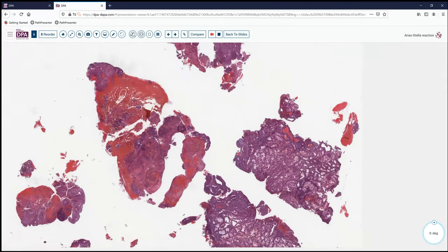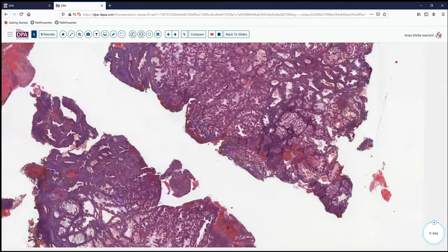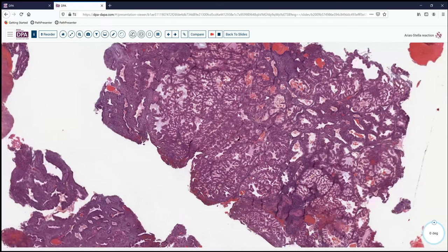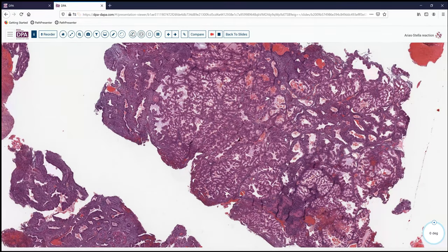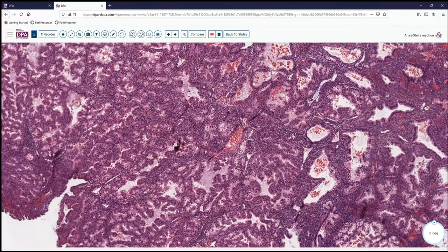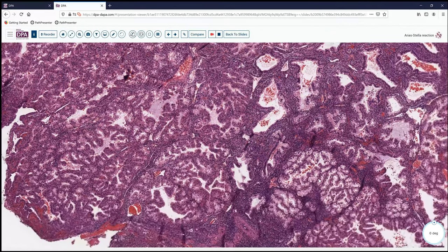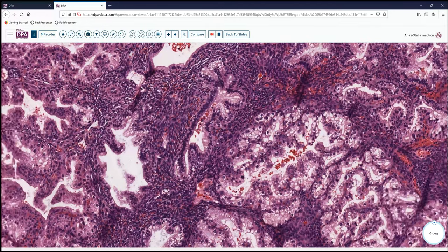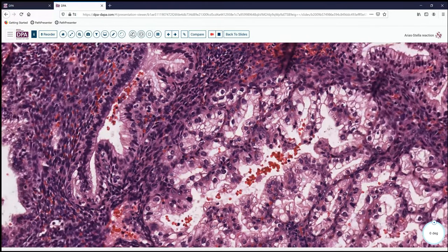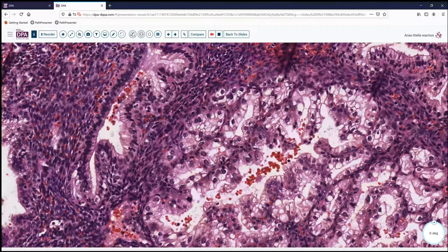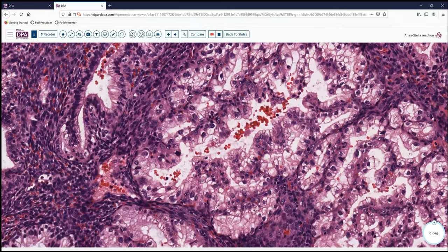However, as we look at this glandular tissue here, we note that it's very densely packed glands, and quite remarkable clear cytoplasm with prominent borders between the cells. A little bit of nuclear pleomorphism and atypia, maybe a few apical cells here, variability in size and shape of the nuclei.